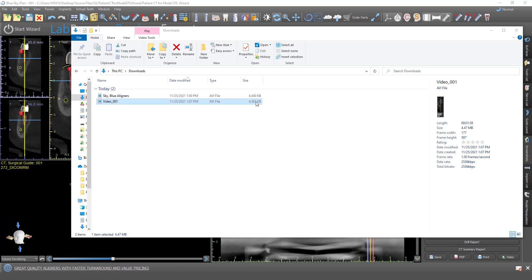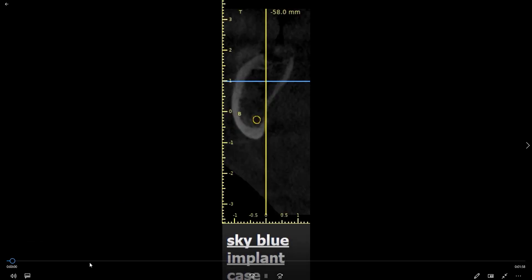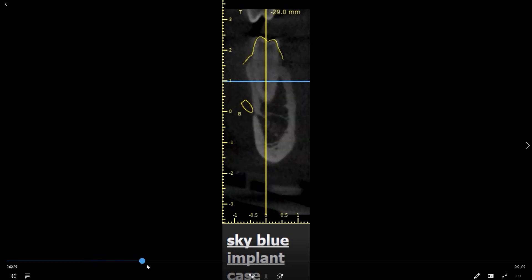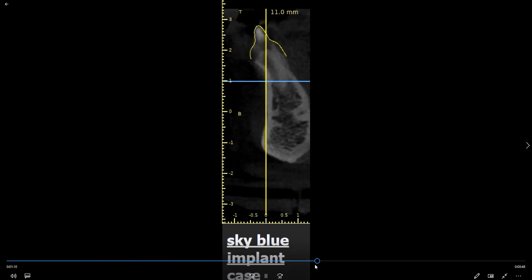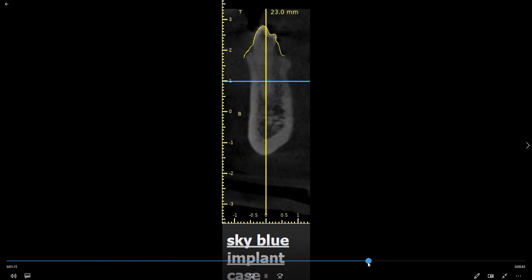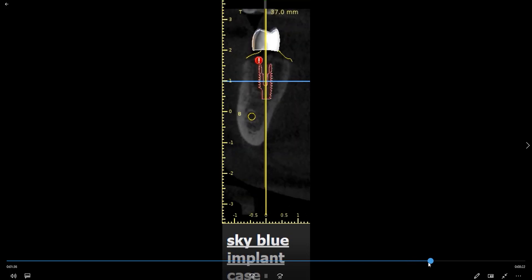And what we have here is our video. It's four and a half megabytes, so it's very easy to transfer and share. Go ahead and double click it. And then what we have is just going around the arch showing the different slices. Let's jump forward a bit.